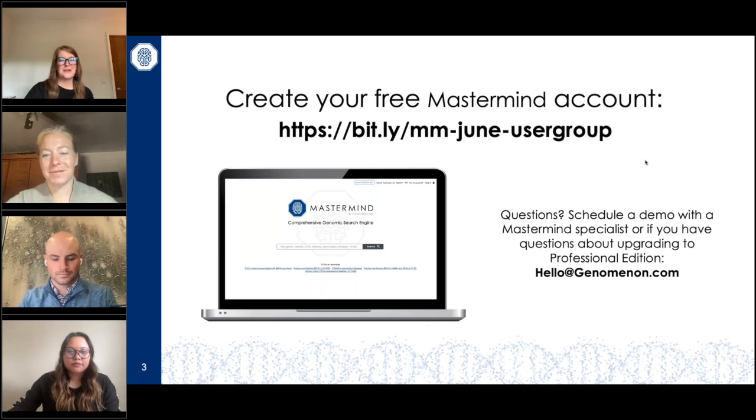Okay, great. And we have a question from Natalie. Hi, Natalie, we're happy you're here. I may have missed this, but for fusions, can you search for fusions containing one specified gene in any gene partner? So for example, searching for fusions containing PIK3CA as a C terminal partner with any gene as the N terminal partner.